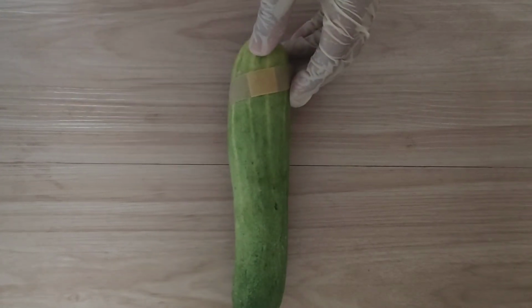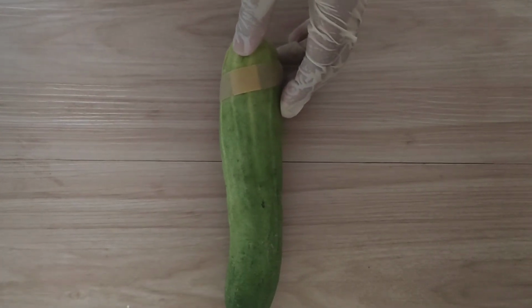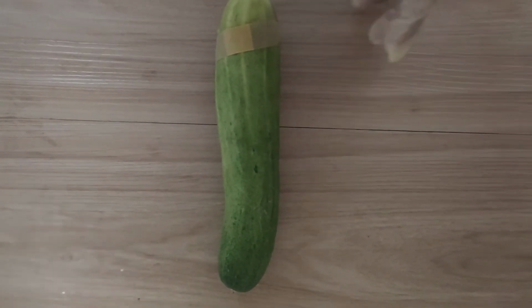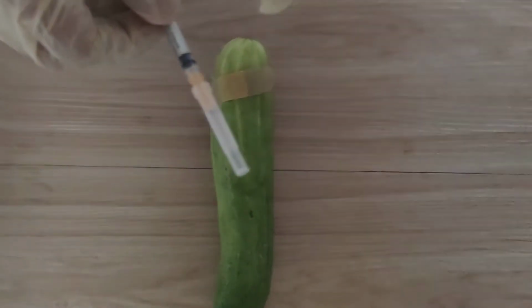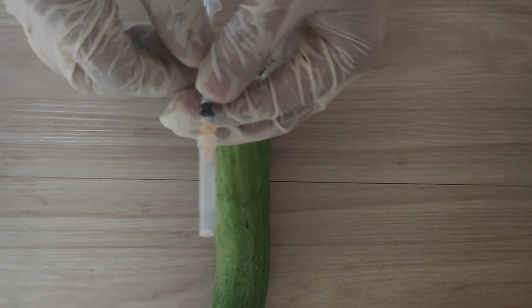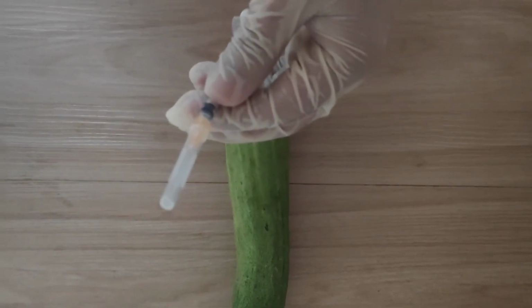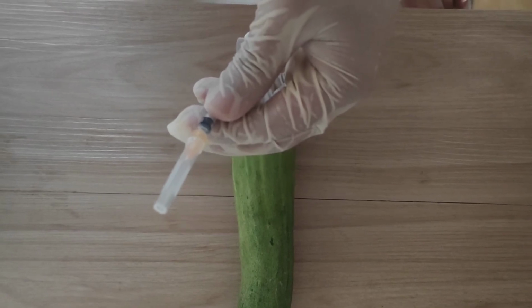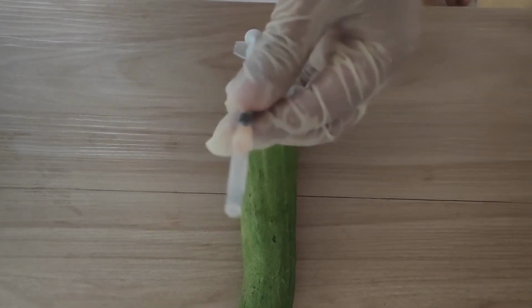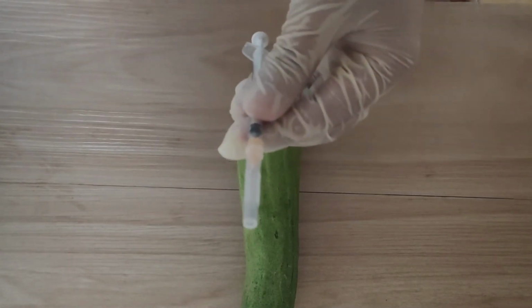Next, protect the blood sample. Hold the syringe upright, express any air bubbles rapidly. Seal the needle immediately using a rubber stopper or cup. Air bubbles may alter laboratory test results. Specimen must be kept airtight to prevent alteration of test results. Roll the syringe gently to mix blood and heparin.